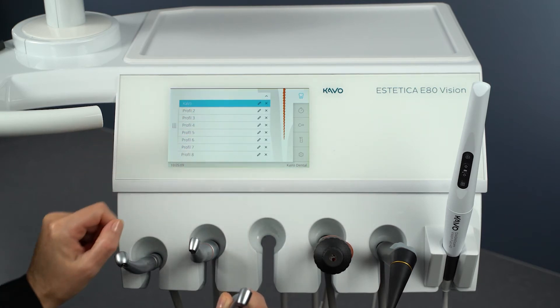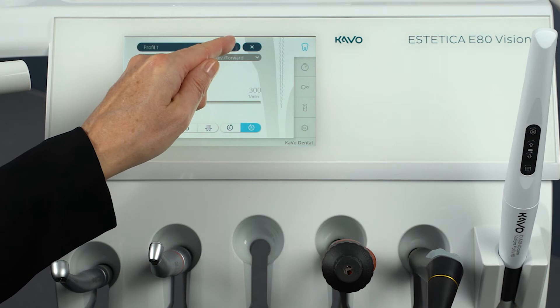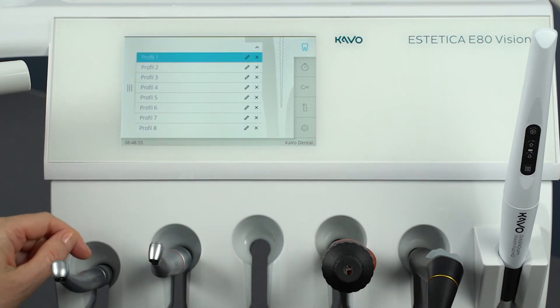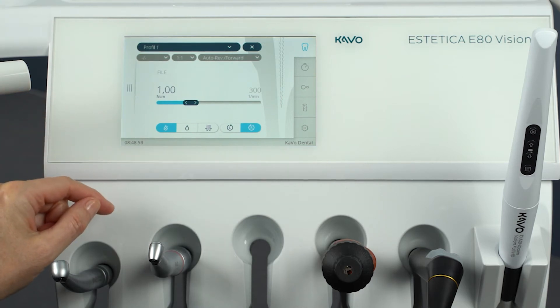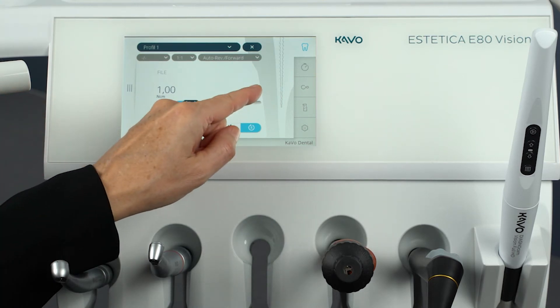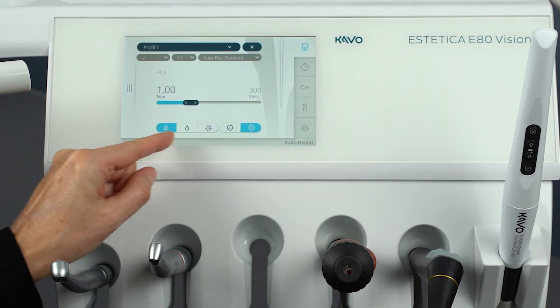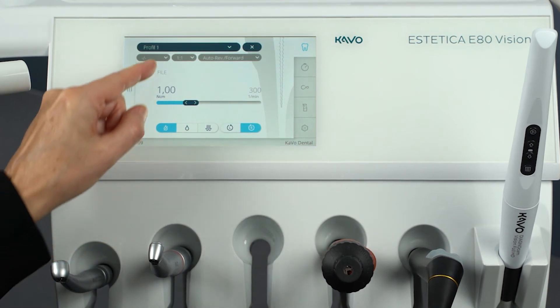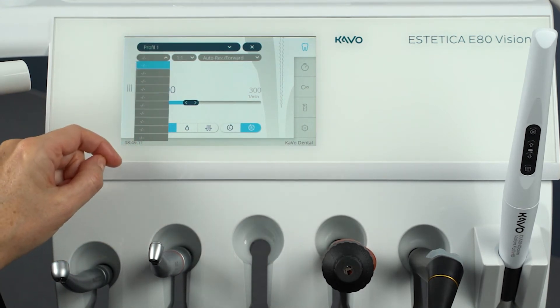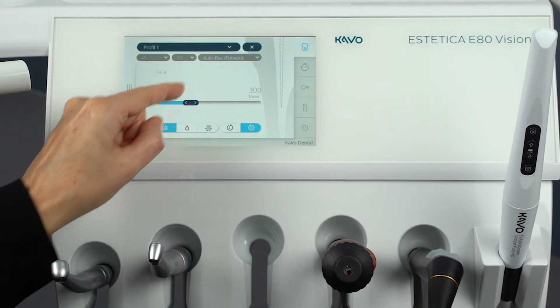Eight parameter storage locations — Profile 1 to Profile 8 — are available. The following parameters can be changed individually in each profile: Speed, Torque, Cooling Condition, Direction of Motor Rotation, File Selection from the file database, Transmission Factor, and Torque Mode.